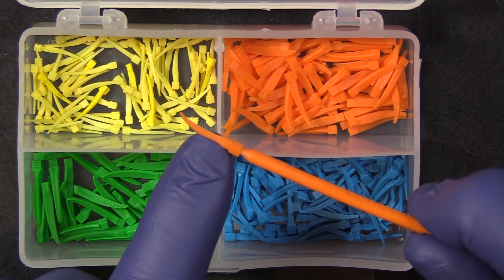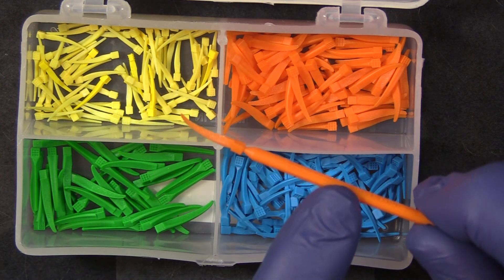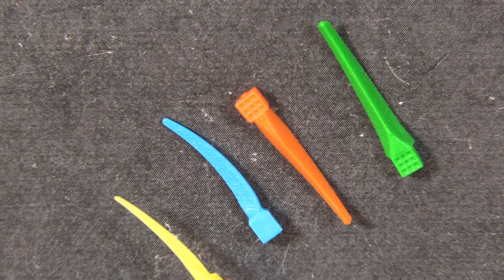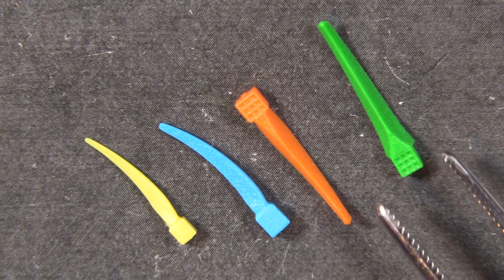After we got enough requests for it, we went ahead and made the G Wedge, which is a Wedge Wand without the handle. All of Garrison Wedges come in four different sizes, from the yellow, which is extremely small and thin, all the way to the much larger green.